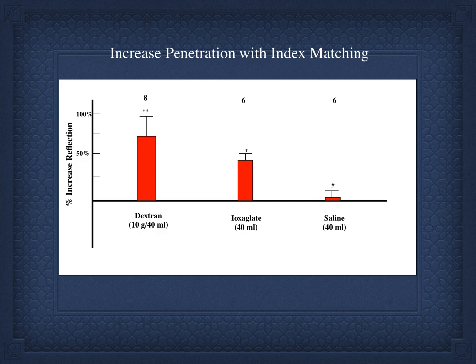And so Dextran was great. At some points it got up to 100% of the penetration back, or close to 100%. Contrast medium was around 50%. When it says saline here, this is not compared to pumping saline through the tubing. It's the saline vehicle that we used with the Dextran to show that it wasn't being caused by the vehicle. So it was blood with a small injection of saline in it.